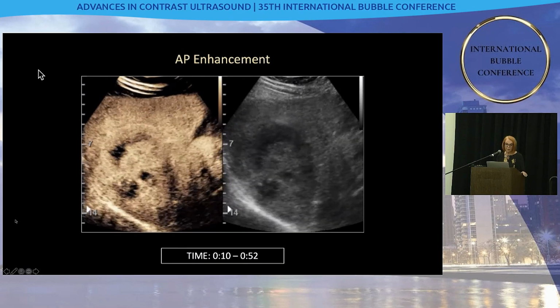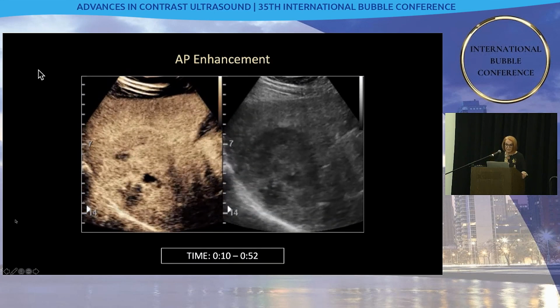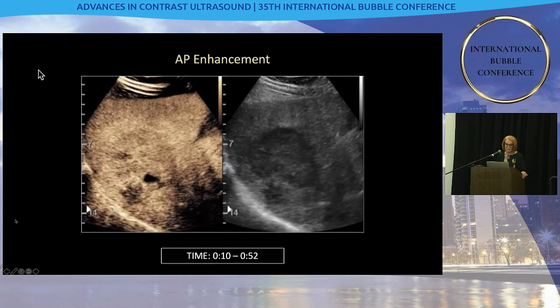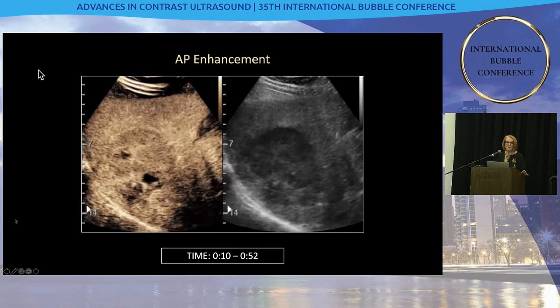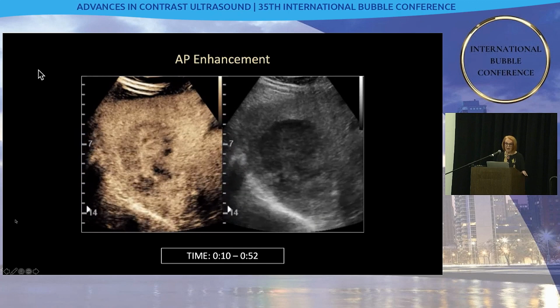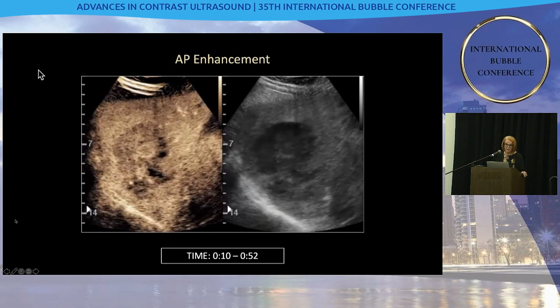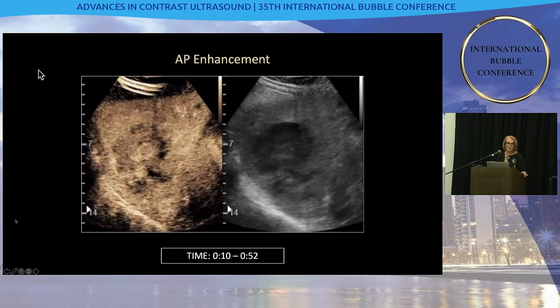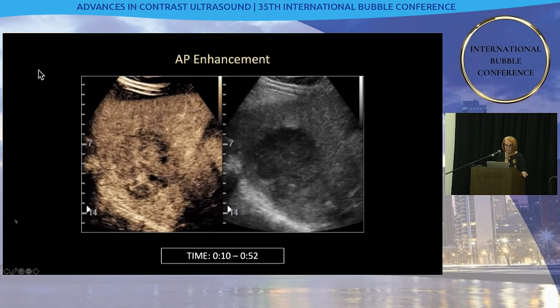So when we look at the ultrasound, we can see that this big mass has got rim hyperenhancement and a big ball of hyperenhancement centrally within this mass. So again, we're letting this clip run a few seconds longer than we often do, and we can see that before our eyes, again, the mass will go from hyperenhanced to less enhanced than the liver. So we show washout within the time frame of a short clip performed all before 1 minute.